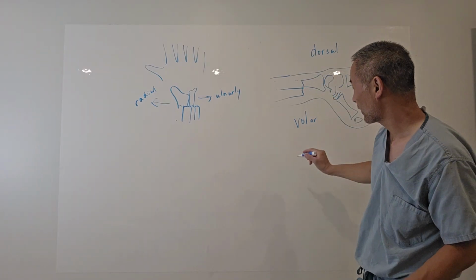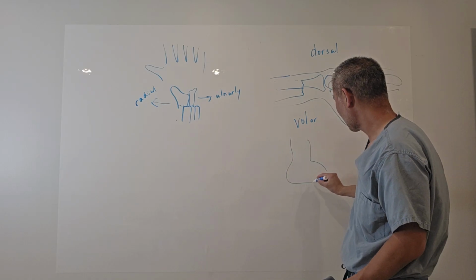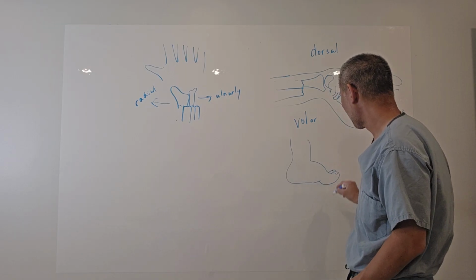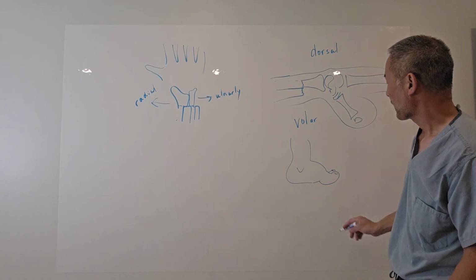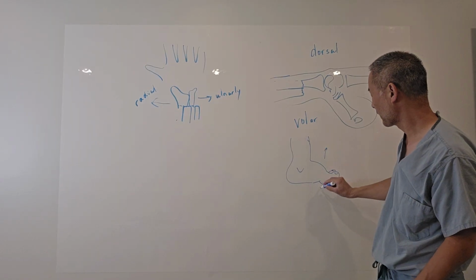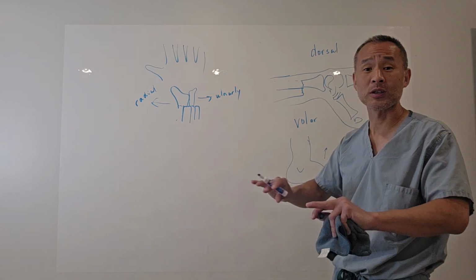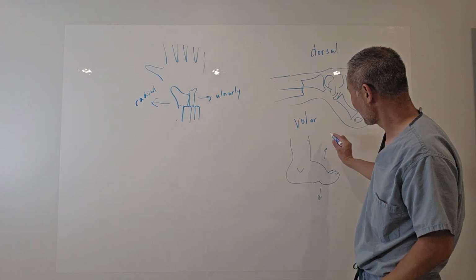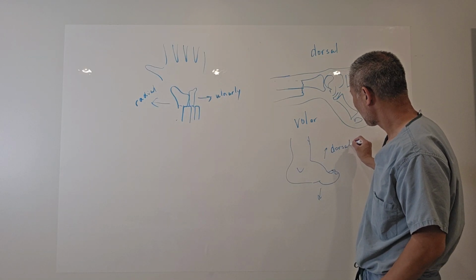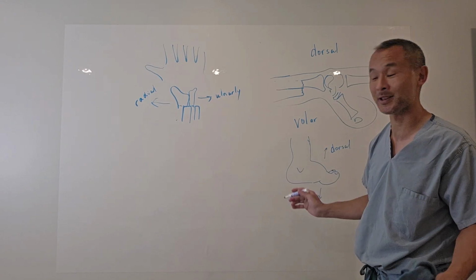And we use the same kind of convention. So say we have a foot here. It looks like this is the best foot I could draw. There are little toes here, and here's a malleolus. So similarly, knowing which is anterior and which is posterior depends on the anatomical position. Again, we just get rid of that confusion. If it goes this direction towards the dorsum of the foot, we're going to call it dorsal. And if it's going towards the floor, towards the sole of the foot, we're going to call it plantar.